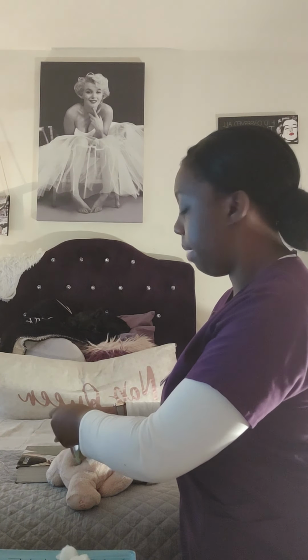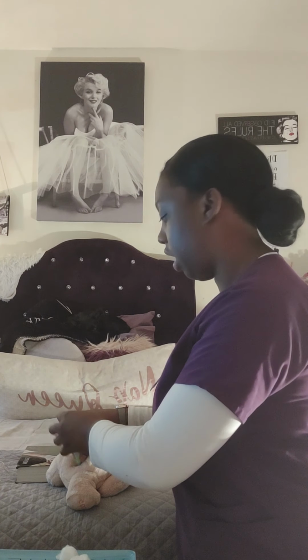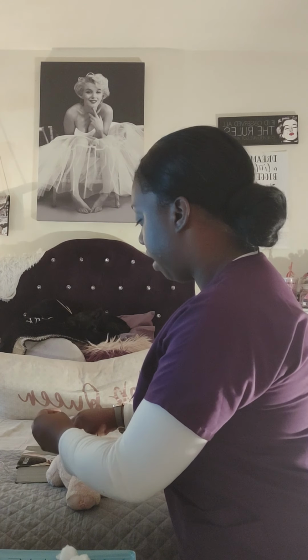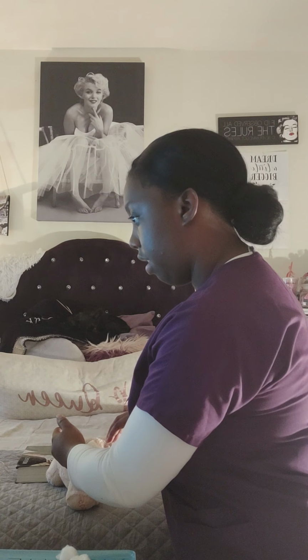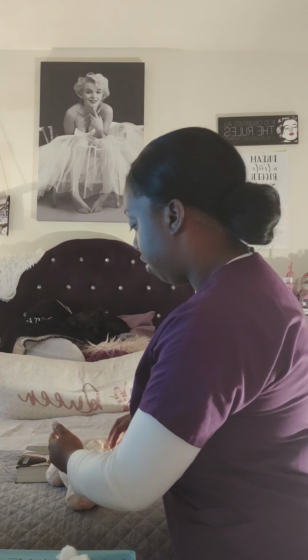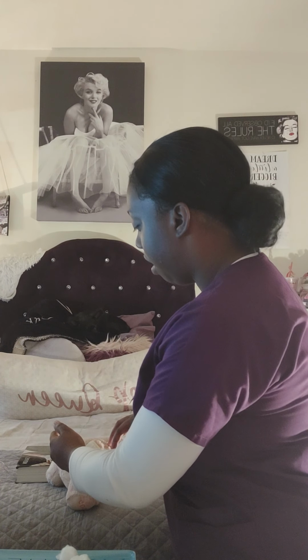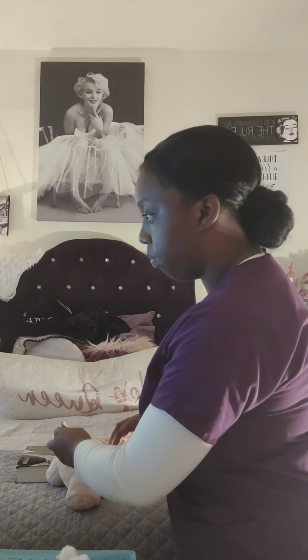What we're looking for is basically making sure that there is no blood coming into the medication. If you do see blood, that normally means that you're in a vein. If you don't see it, then you're good to keep going. So we're just going to put the plunger back in there, and then inject the medication at a rate of 1 milliliter per 10 seconds. Once you've done that, you wait 10 seconds to pull the needle out.